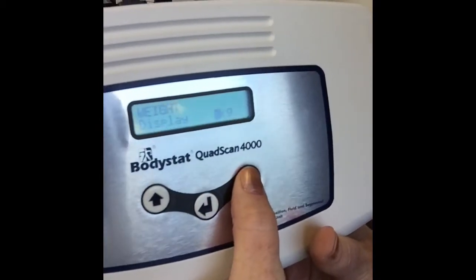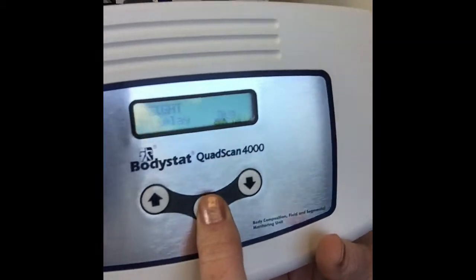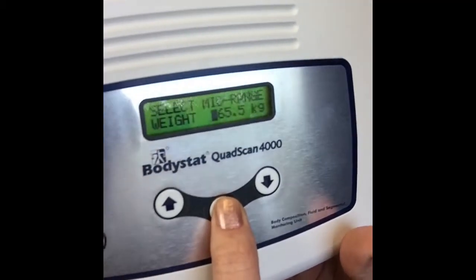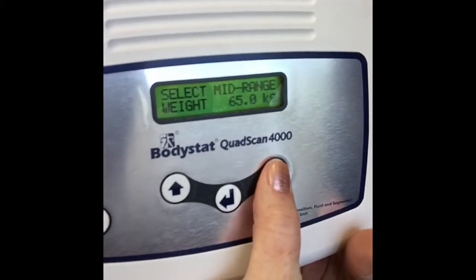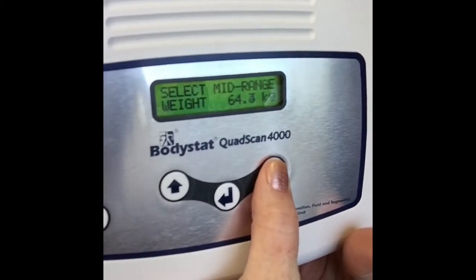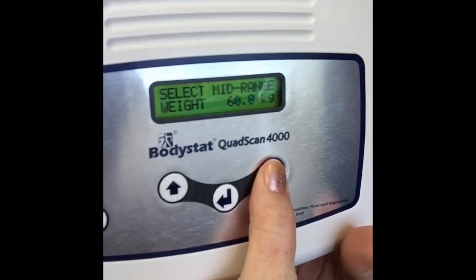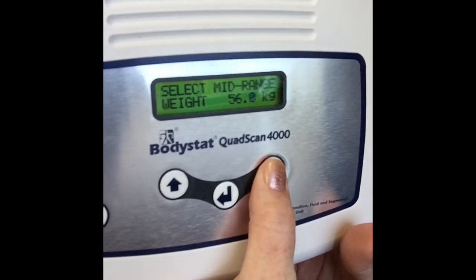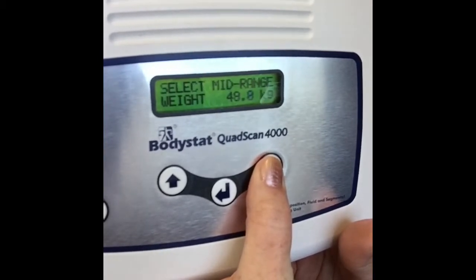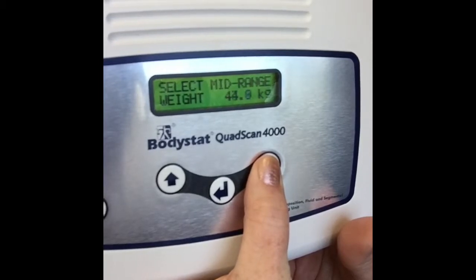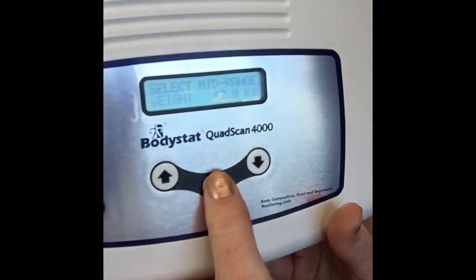Likewise with weight, we can change the units to kilograms, stones, or pounds. We'll keep it to kilograms for now. We can also change the default weight — for example if you're measuring children whose weight is much less than 65 kg, rather than scrolling down to 40 kilograms every test, which takes time, we can default that weight to show up at 40 kilograms every time you do a measurement. It just saves time. So for example we'll set it to 42 and click through.